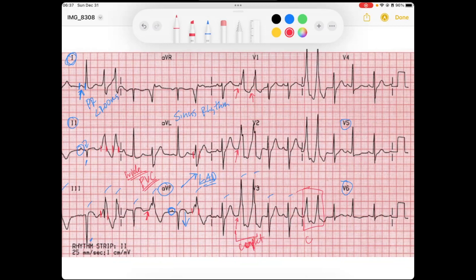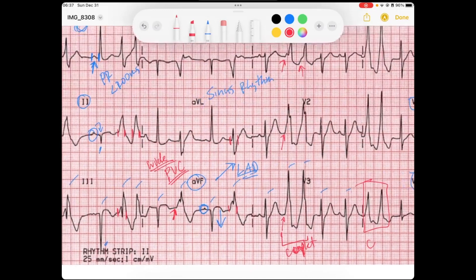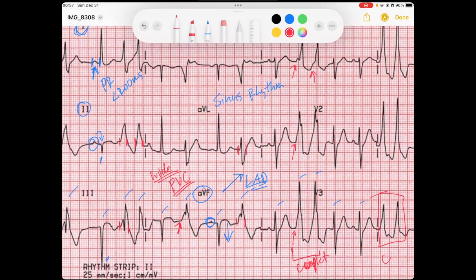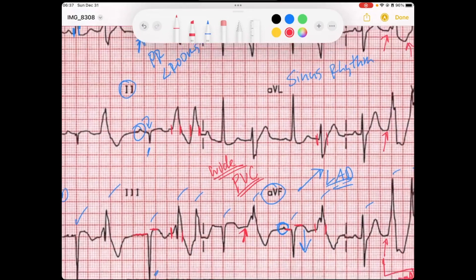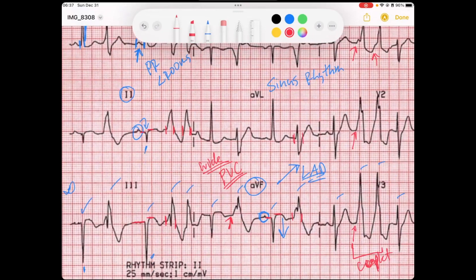Now let's scan through our leads for ST and T wave abnormalities and pathological Q waves. In the inferior leads, I've got some ST elevation — here's my baseline and here's my ST segment. That's ST elevation in lead three, aVF, and lead two has maybe a little bit less but still some elevation.